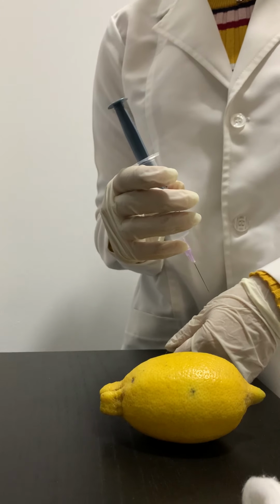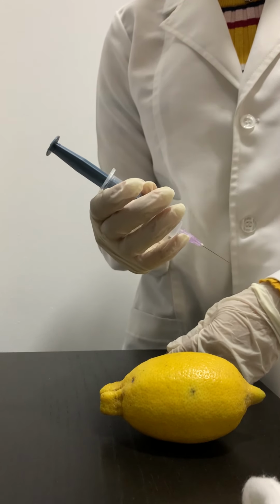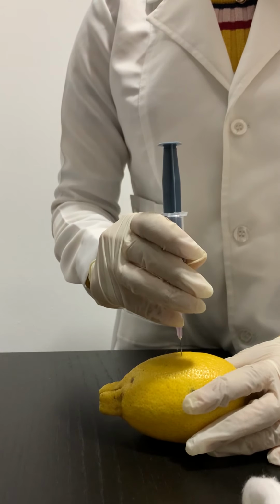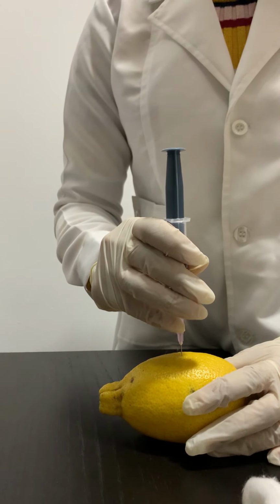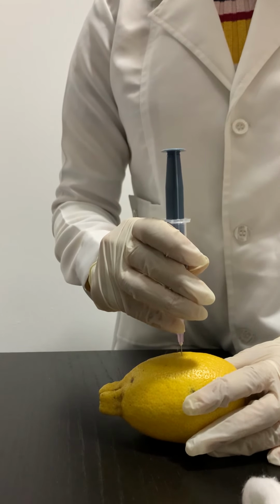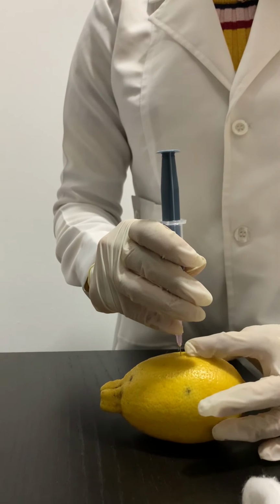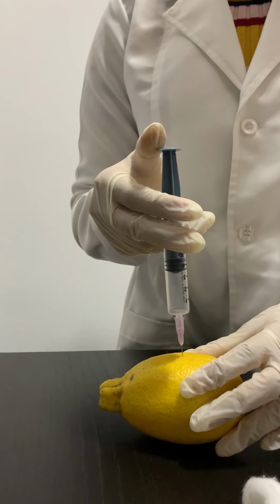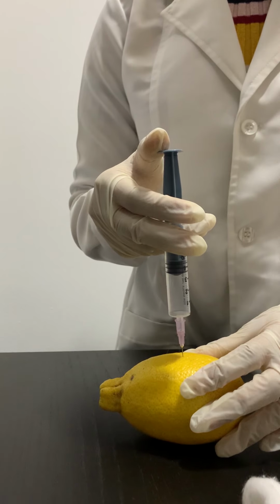Also remember that the injection site has already been cleaned with antiseptic solution. The needle is advanced at 90 degrees. It's advanced as fast as possible to avoid pain. As you can see, I have left 1/3 of the needle outside. Once it's inside the muscle, we may pull back on the plunger to see if it has hit any capillary or vein.